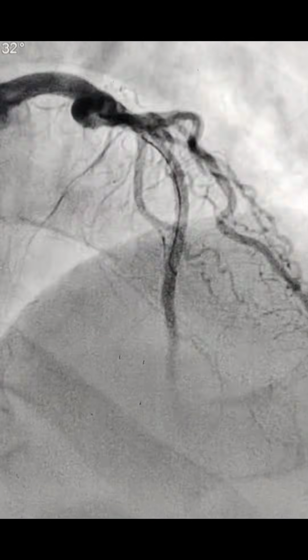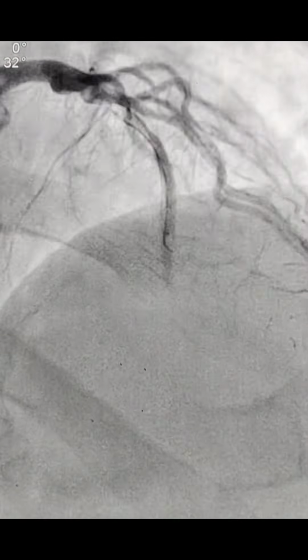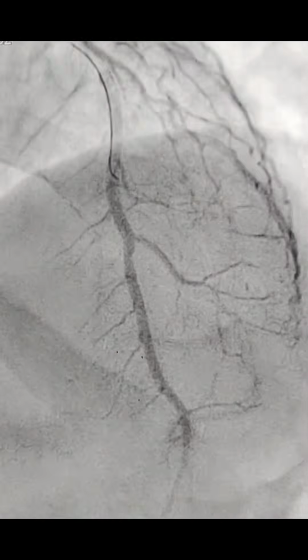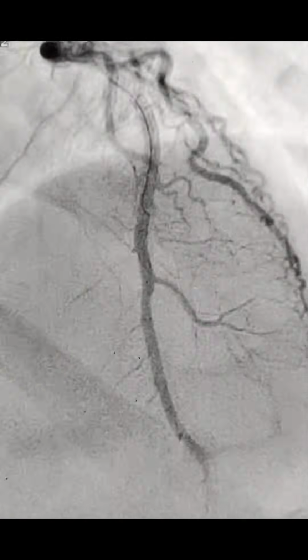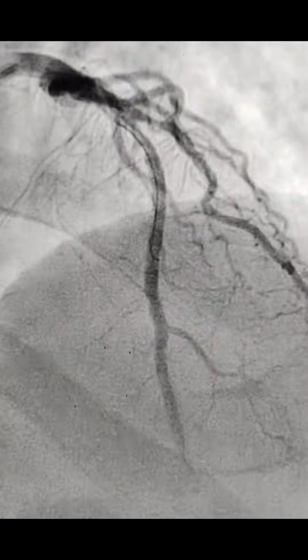So with the right femoral approach, we crossed the Whisper PTCA wire, and you could see that the major LAD has opened up with slow flow, and there is a thrombotic lesion in the proximal part. The mid portion of the LAD is almost around 3, and then proximal is 3.5. So we decided to put 2 stents. One is in the mid portion where the thrombus is, 3 by 20, and then in the proximal we deployed 3.5 by 24, and then we overlapped.